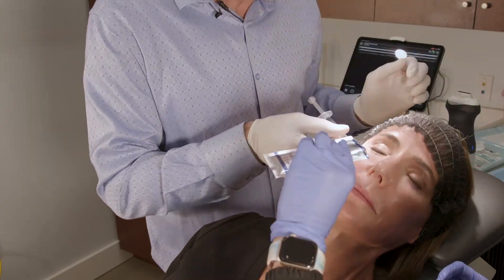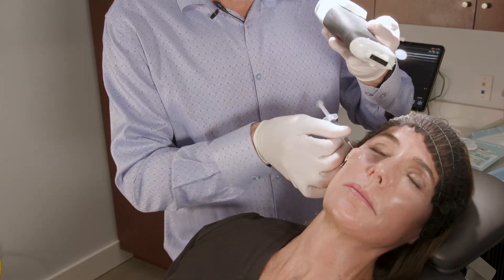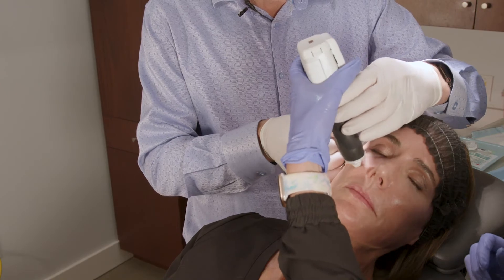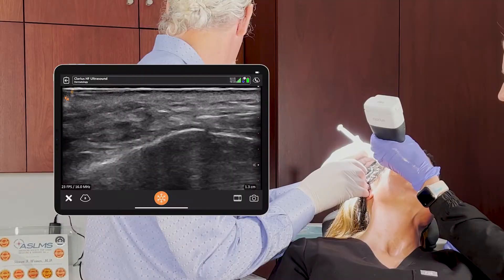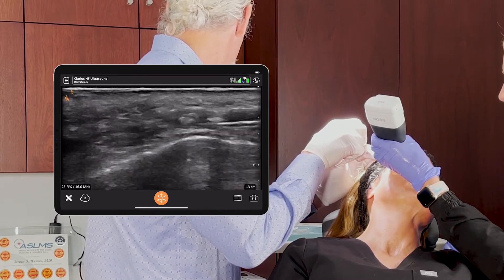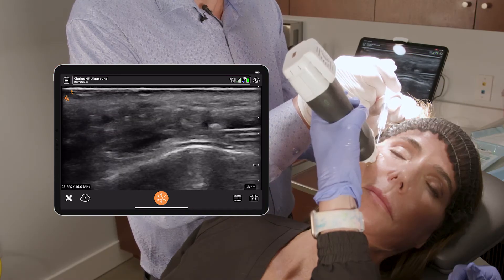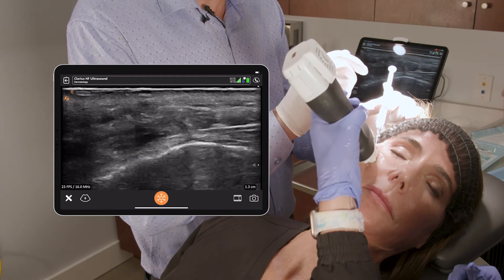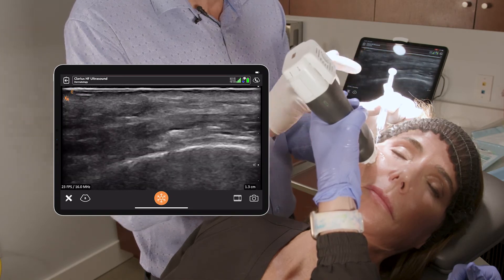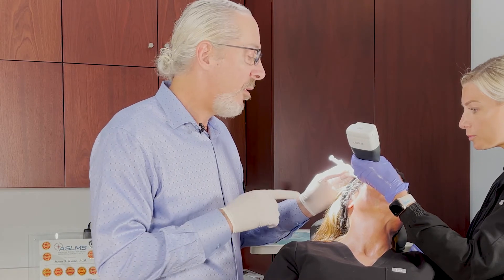Now we're going to confirm that position using the ultrasound. I'll hold it about right here. There I am below the SMAS, and you can see that I'm injecting in the prezygomatic space along the periosteum. That is a prezygomatic space injection with ultrasound guidance — a very safe plane to inject your cheeks.